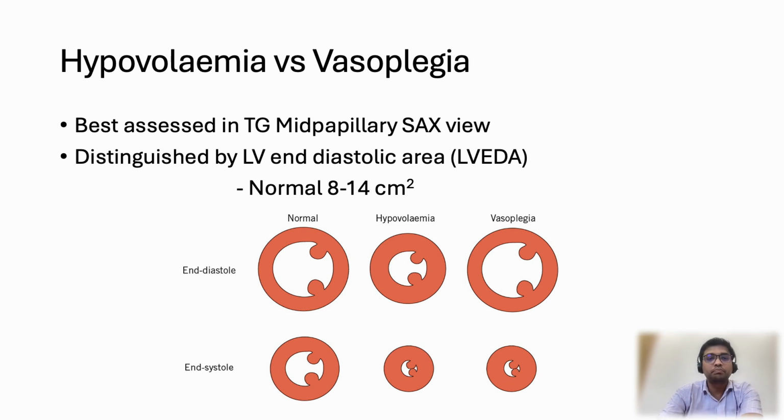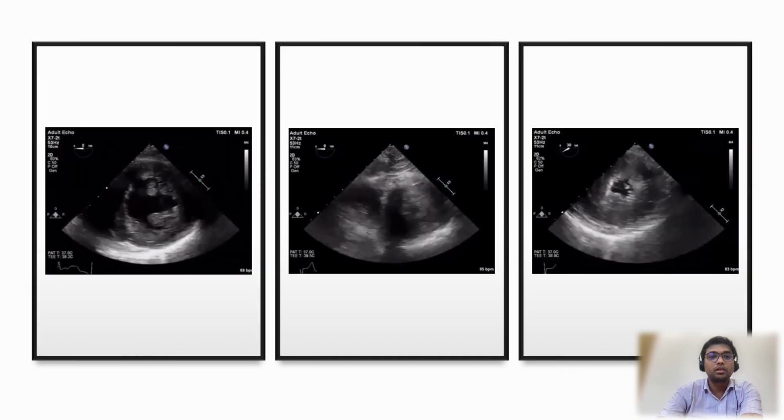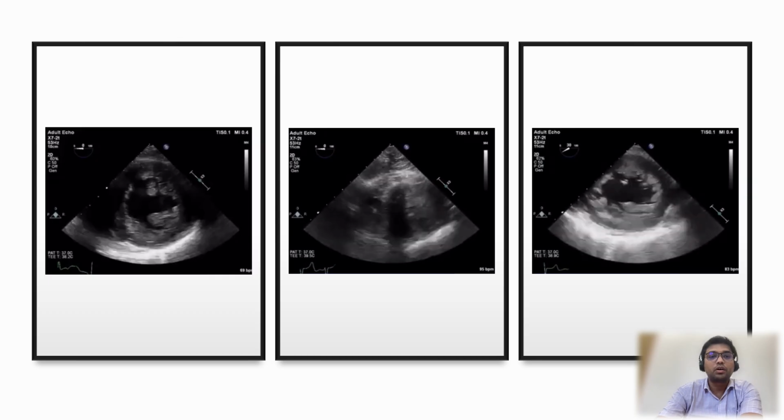So by looking at an example, this on the left is the normal, and this is your hypovolemia.